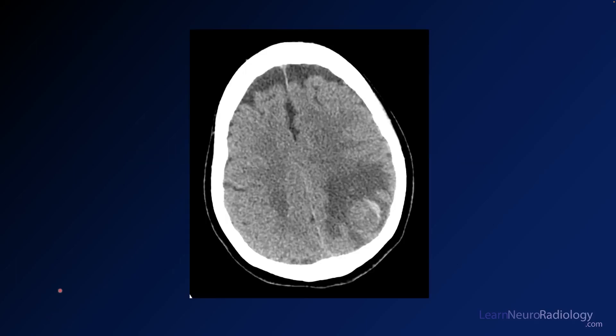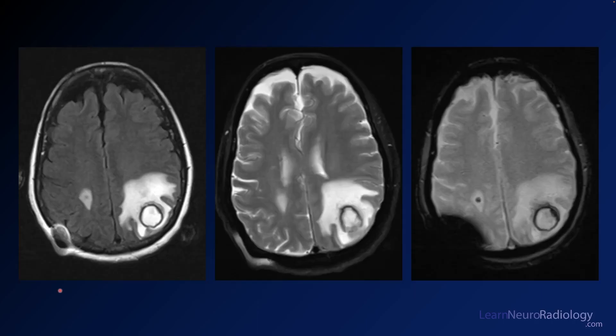Here we have a single image from a CT. Take a look at that and kind of formulate where you think the major abnormalities are. Now we have some MR images through approximately the same level in the same patient. On the left you have a FLAIR, in the middle a T2, and on the right a blood-sensitive sequence such as a GRE.